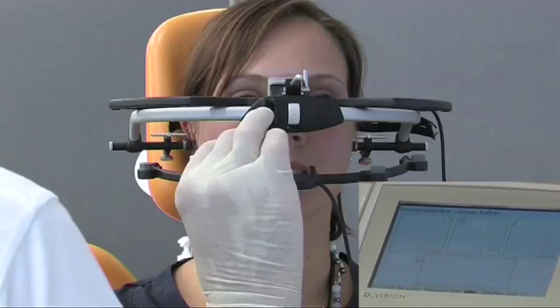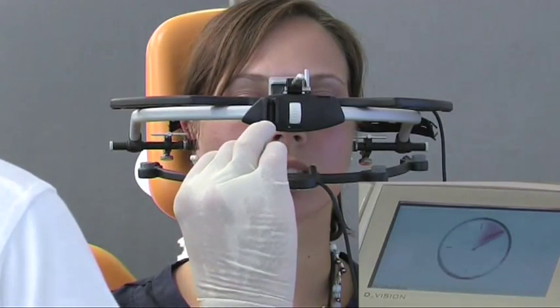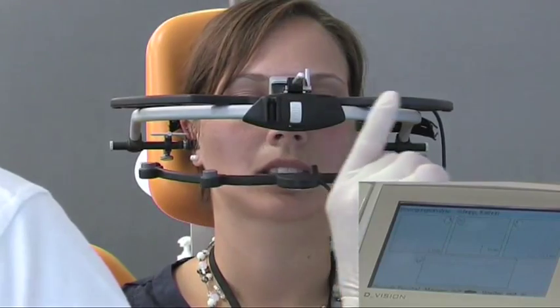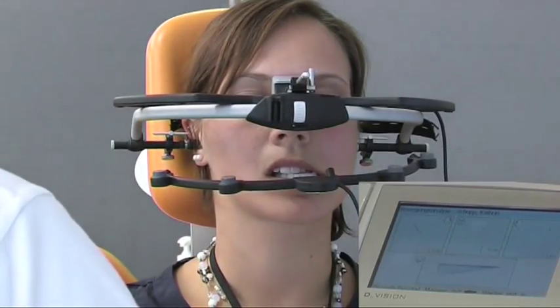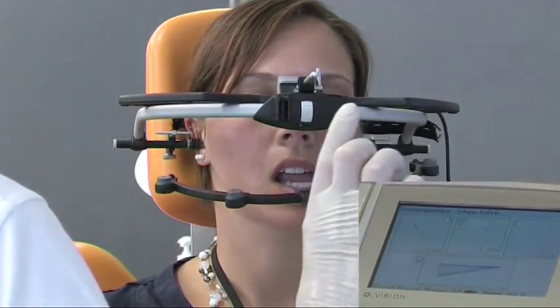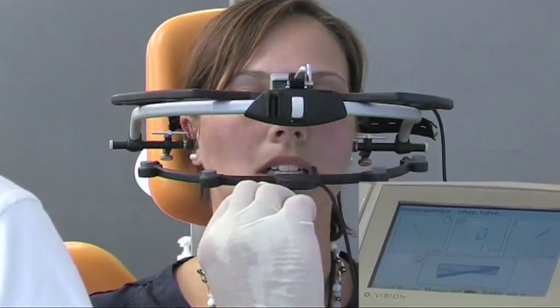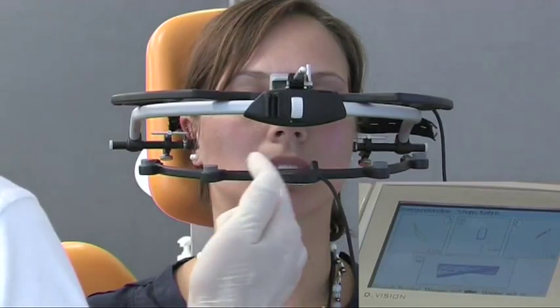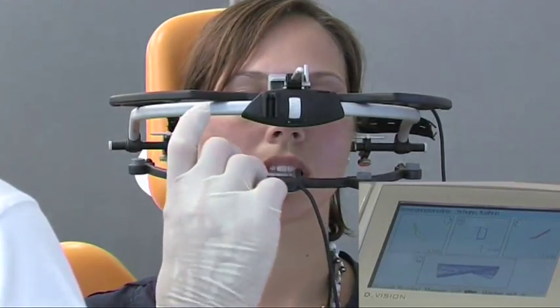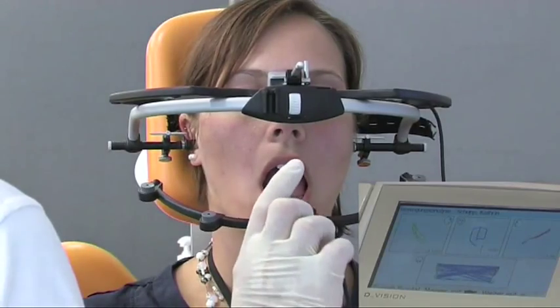Next, the patient moves the lower jaw to the left, opens wide from this position in the midline and bites down from the maximum opening. The same movement pattern is also carried out to the right.